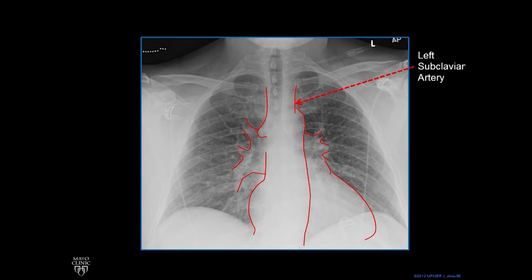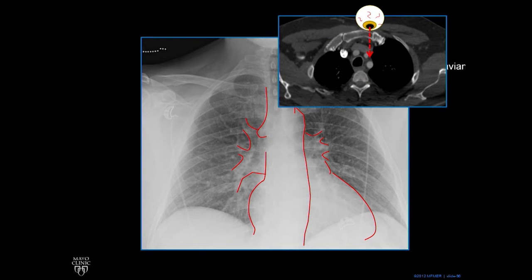Now we're moving to the left side of the cardiac silhouette. This line up there, superiorly to the patient's left — to your right, but the patient's left, because they're looking at you — is the left subclavian artery. The bright white dot is the superior vena cava, and these three gray dots are vessels that come off the aortic arch. The last one is the left subclavian artery. You can see how, because it makes a border with the lungs, it shows up on the chest X-ray in this patient.